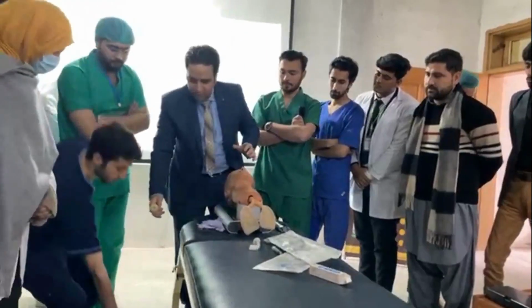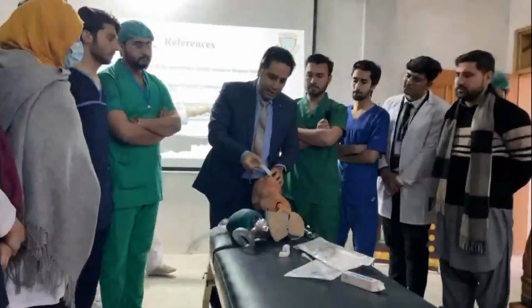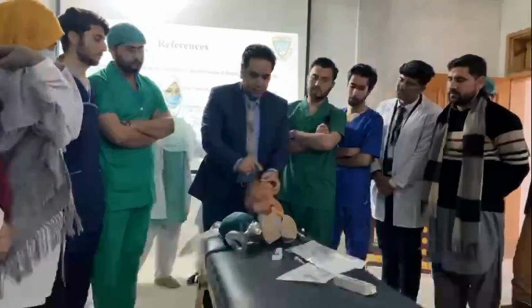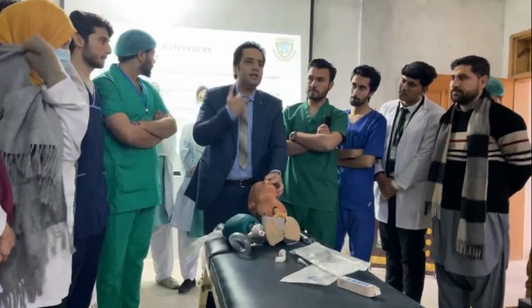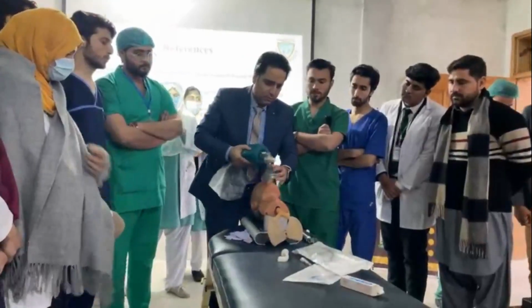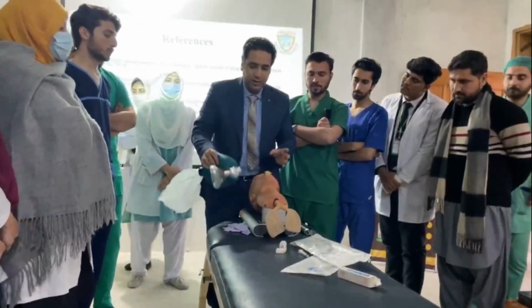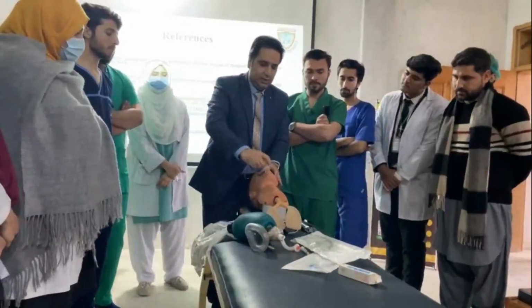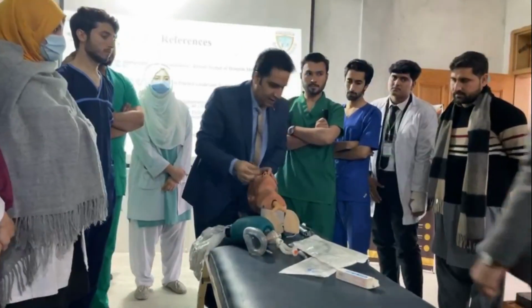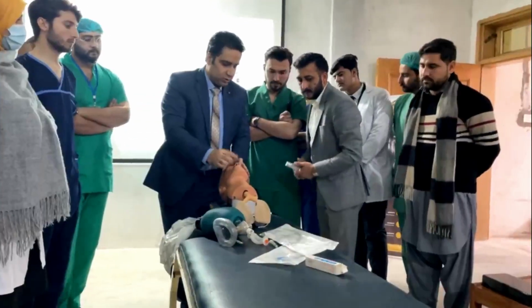If the patient is dropping the jaw, you can place the airway inside the mouth. Then the tongue fall or any obstruction will be relieved, and you can put oxygen directly into the lungs. If the airway fails, then we have the nasal airway as well. You can put an airway in the nose here.